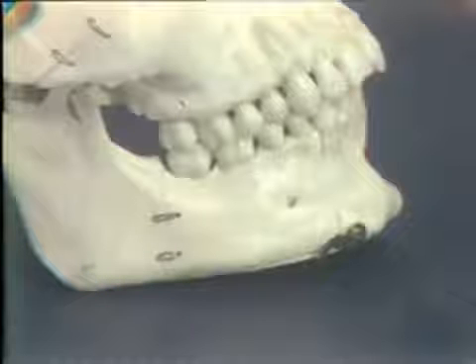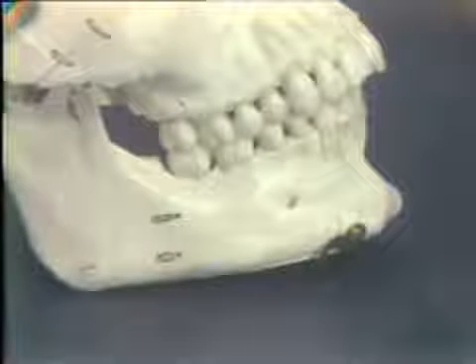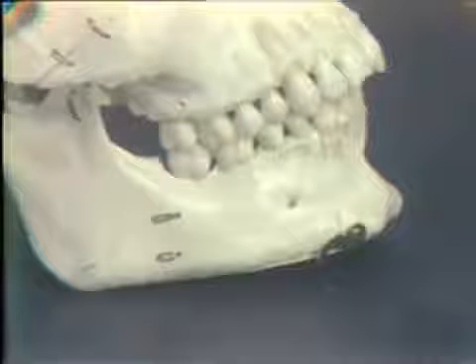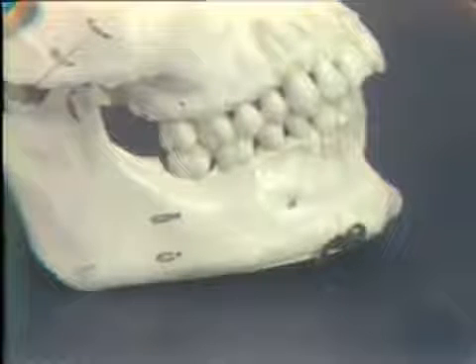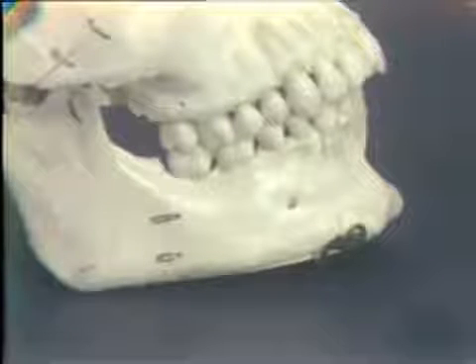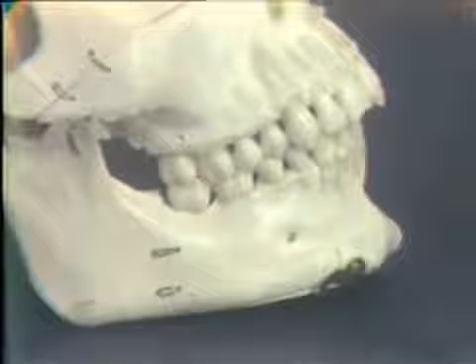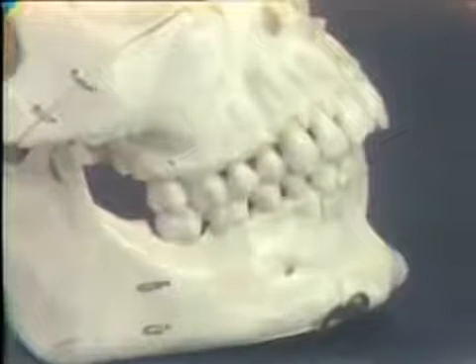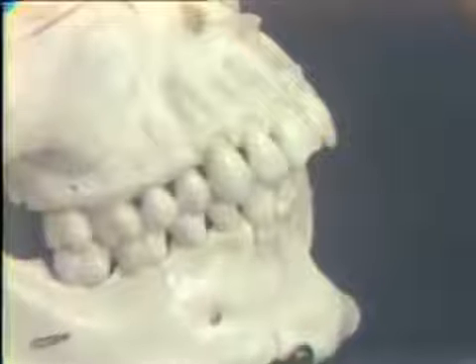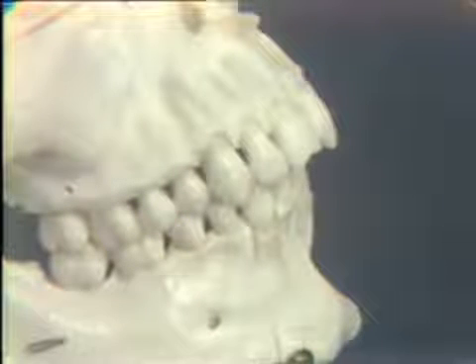Let us now depict anesthetizing the maxillary cuspid, and in so doing, we'll recall that the nerve supply to the cuspid and the incisor teeth is the anterior superior alveolar nerves. Remembering again that the cuspid root is a little longer than are the bicuspids and or the incisors.